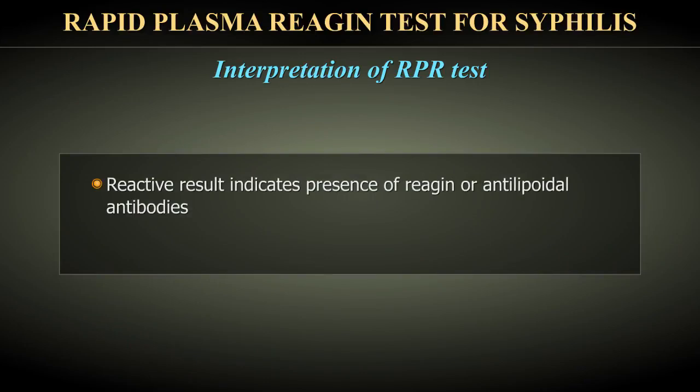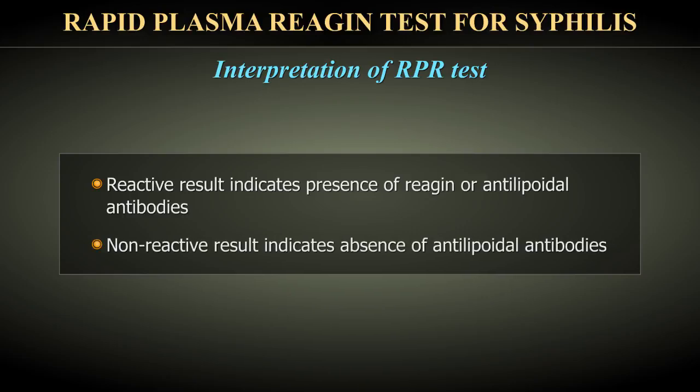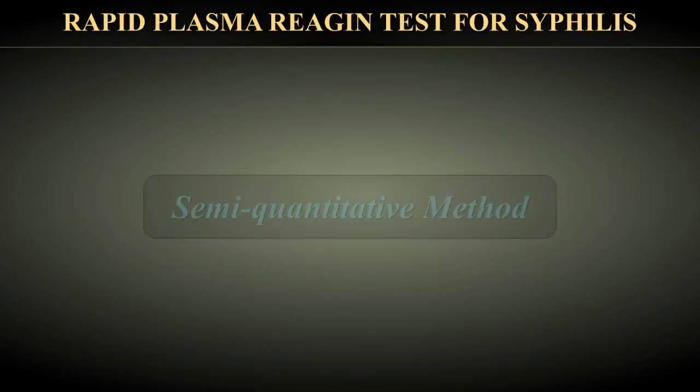Reactive result indicates presence of reagin or antilipoidal antibodies. Non-reactive result indicates absence of reagin or antilipoidal antibodies.